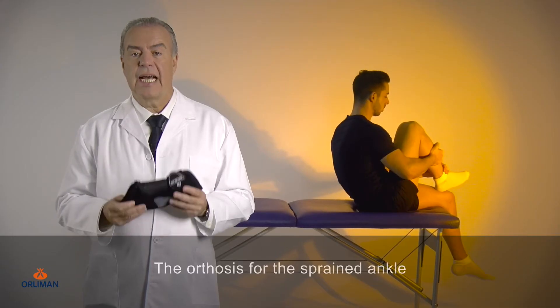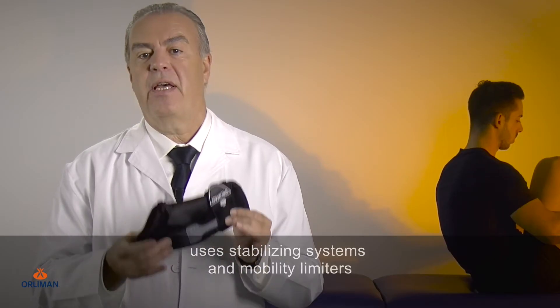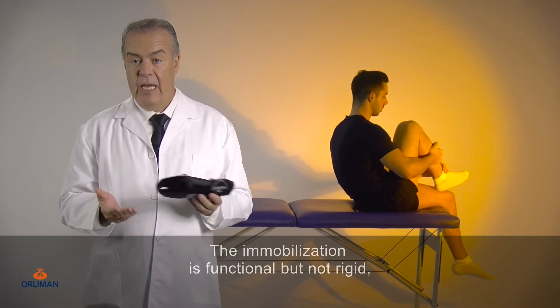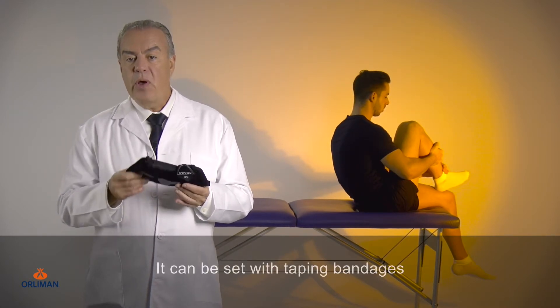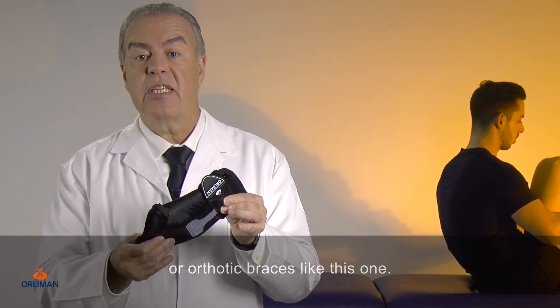The orthosis for the sprained ankle uses stabilizing systems and mobility limiters, depending on the grade of the injury. The immobilization is functional but not rigid, allowing a better cicatrization of the ligament. It can be set with taping bandages or orthotic braces like this one.